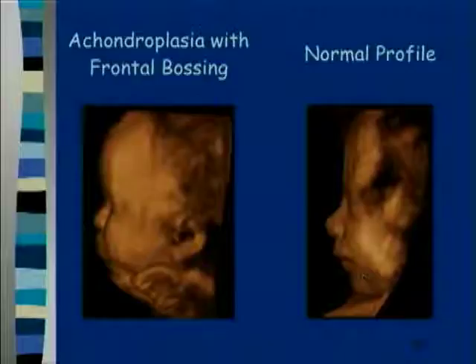We can also look for frontal bossing in patients with skeletal dysplasias to help narrow down whether they might have achondroplasia, like here, in comparison to this normal profile here.